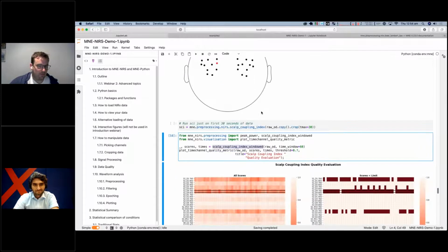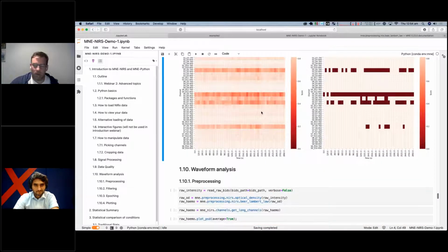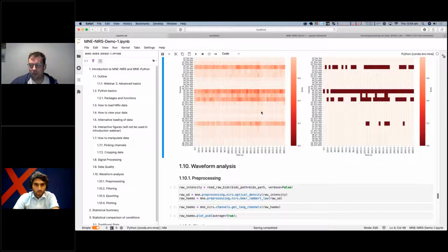All right. Any other questions while we're at it that have come through that are relevant? Not about Beer-Lambert, but there's a question that has repeated a few times, which is about making copies of data. I'll read one of them to give you an idea. Do we have to make a copy of the data before each pre-processing step, or can we have one copy? It looks like you're always making new copies. Do you keep the previous steps in the copy?